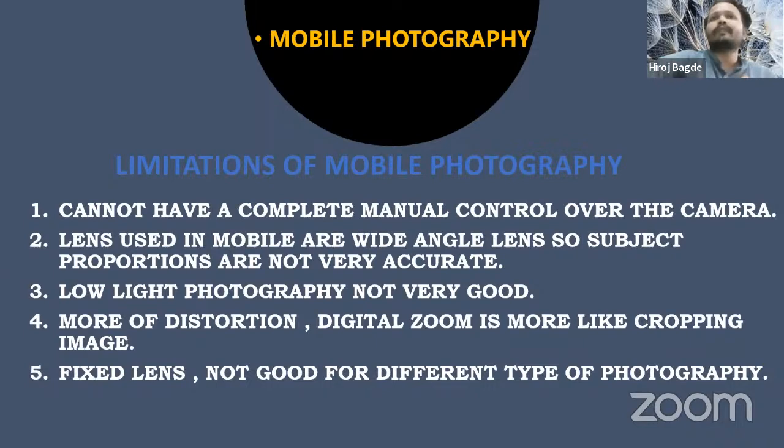In mobile photography, when we are talking about macro, we are going to play with the f-stop number, which will increase or decrease the focus area. So I want to have control over the f-stop, which is hardly there, and which can be manipulated to a smaller extent in some mobiles, good mobiles. But yes, again, I'm telling you, I'm not against any mobile photographers. Mobile photography has evolved a lot, and we are expecting different kinds of changes again in the future. So many changes are expected when we talk about mobile photography.